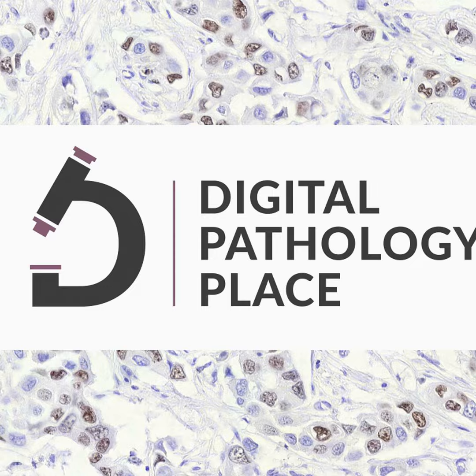Right now, yes, with digital pathology, not everybody trusts it. They want others to do it, even though it has been validated so many times already, right? And if you've done IHC by hand, maybe in your early days, it works some of the time, and then you do it again. Some of the times it doesn't work, and maybe it's twice as dark on Tuesday as on Thursday, and as we know, that just doesn't work, especially for semi-quantitative companion diagnostic type biomarkers.